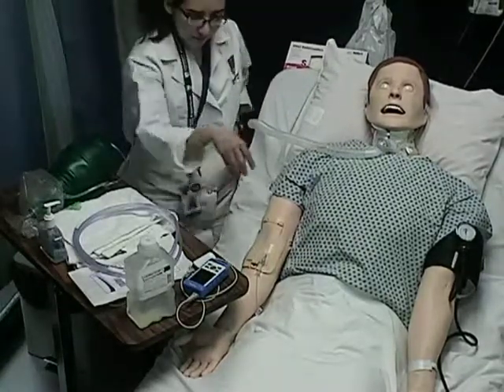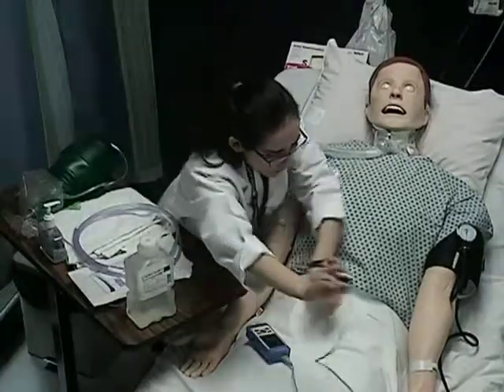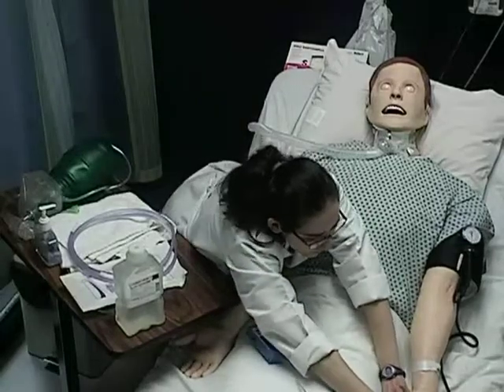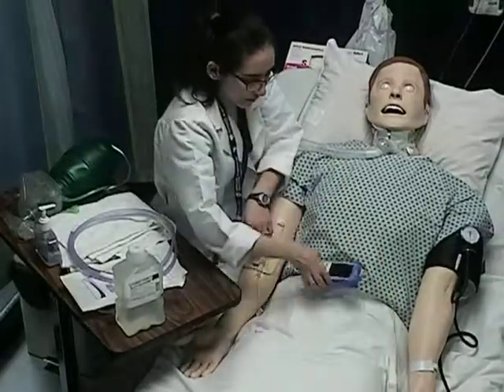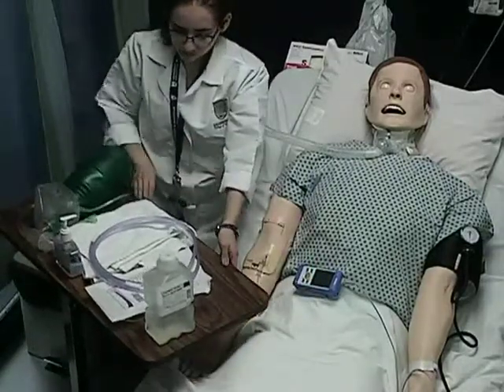Place pulse oximeter on patient's finger. Observe reading and leave pulse oximeter in place. Place towel over patient's chest.